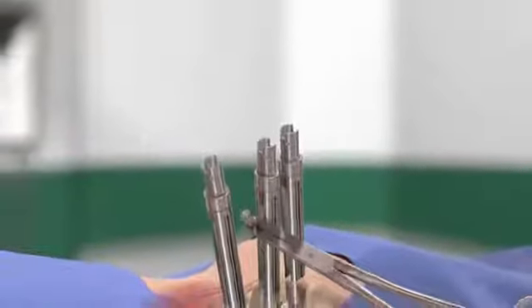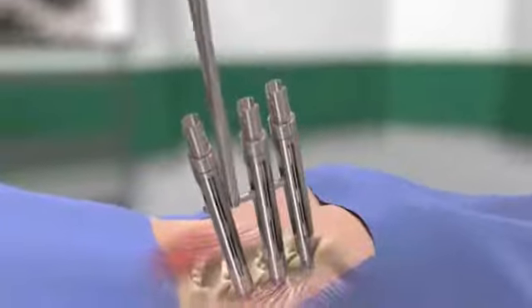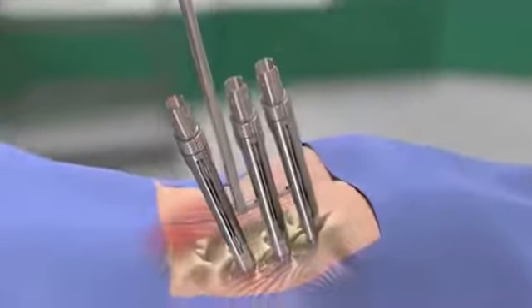After the appropriate rod length has been determined, place the rod with the rod holder. Advance the rod until seated into the head of all pedicle screws.